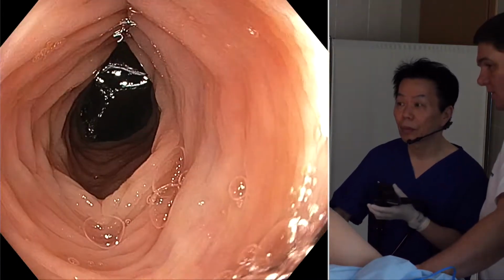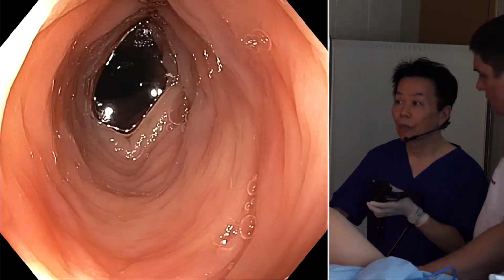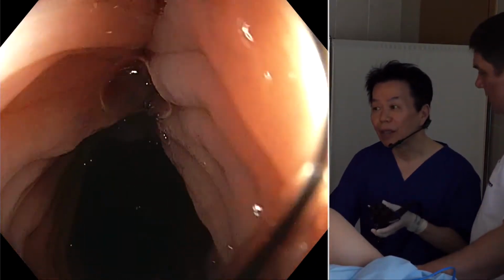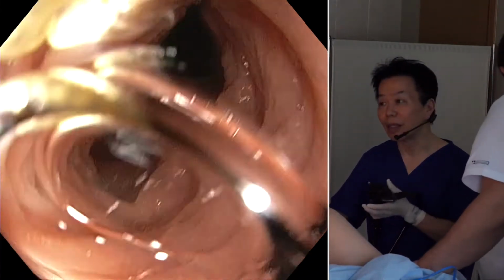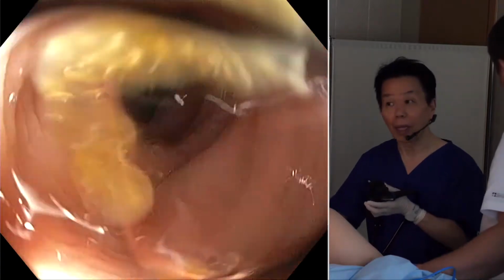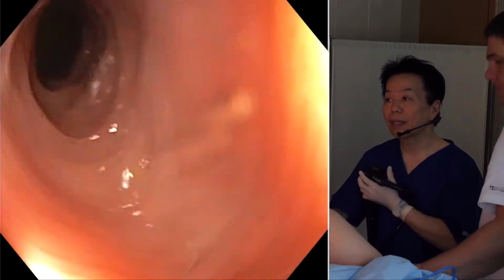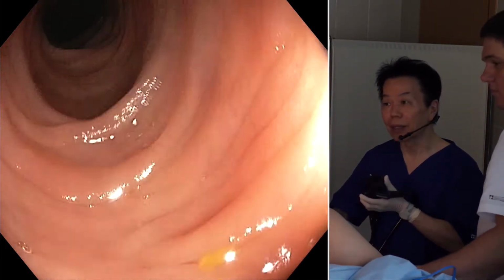The question is, do you use a routine retroflexion in the cecum and in the rectum? Not routinely. Even in the rectum, I don't retroflex the scope, but sometimes, yes. But inflating and deflating air is more important than retroflexion.